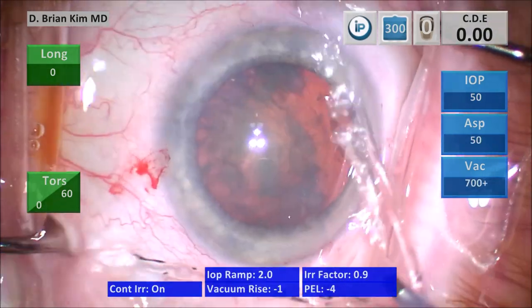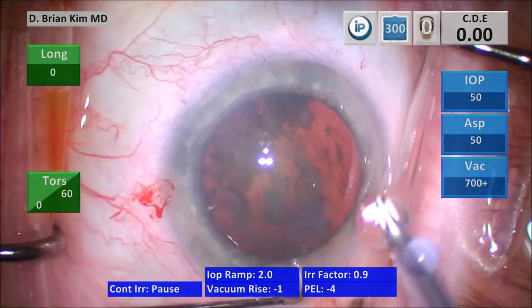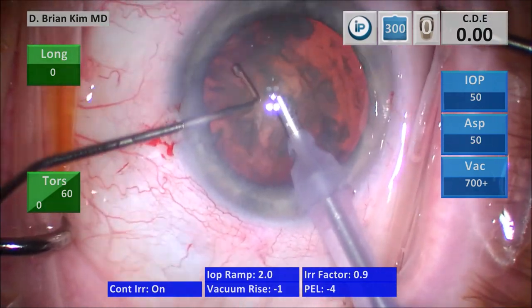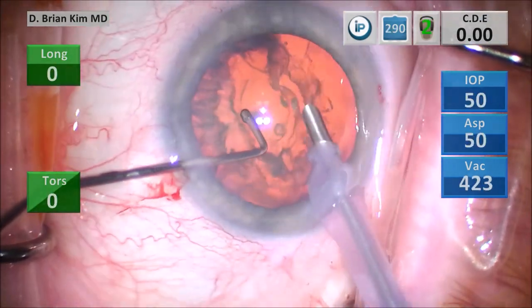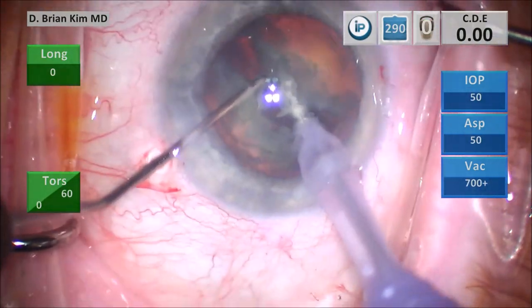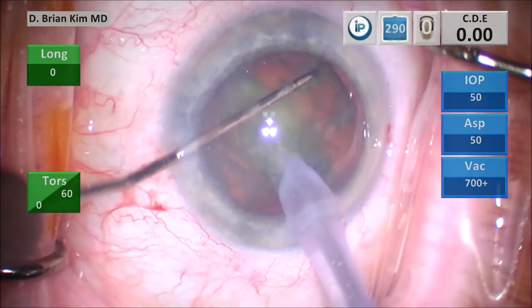I begin the phaco, irrigate the surface of the eye, and then with irrigation off, I'm lifting the corneal incision to minimize Descemet's trauma. I'm going to remove the surface epinuclear material, place the chopper under the epinuclear ridge out to the capsular equator, turn the phaco tip vertically sub-incisionally. I'm able to crush the lens with the chopper and the phaco tip — this is double chop.